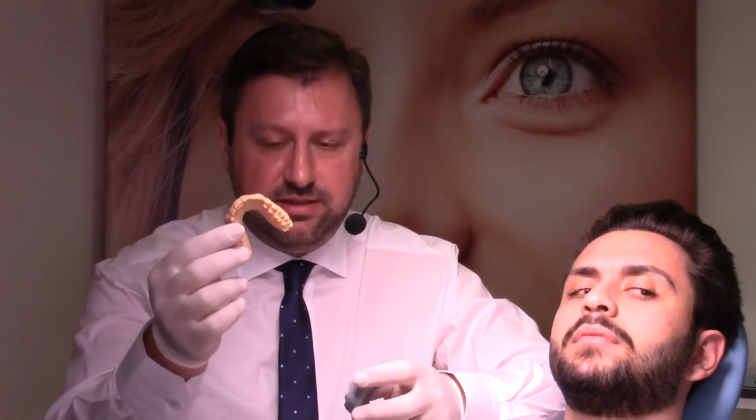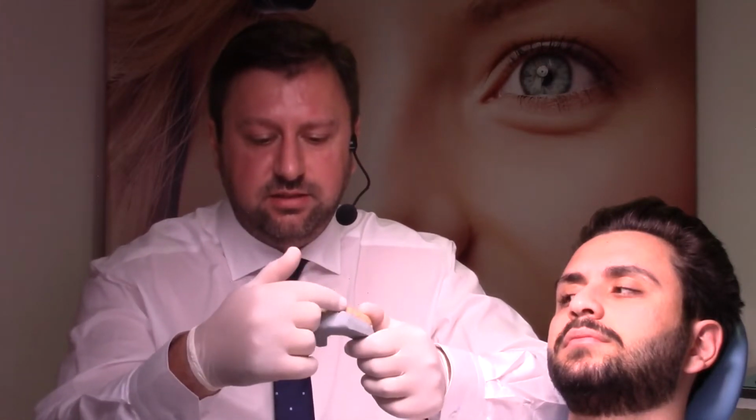Okay, so now you'll continue to show us how to make the best mock-up for this patient, by doing a mock-up with a composite, with a bisacryl composite. Yes, exactly. Over this printed model, we did a silicone index. We cut it according to the gingival level of the teeth, as you see. We will try it in the patient's mouth.